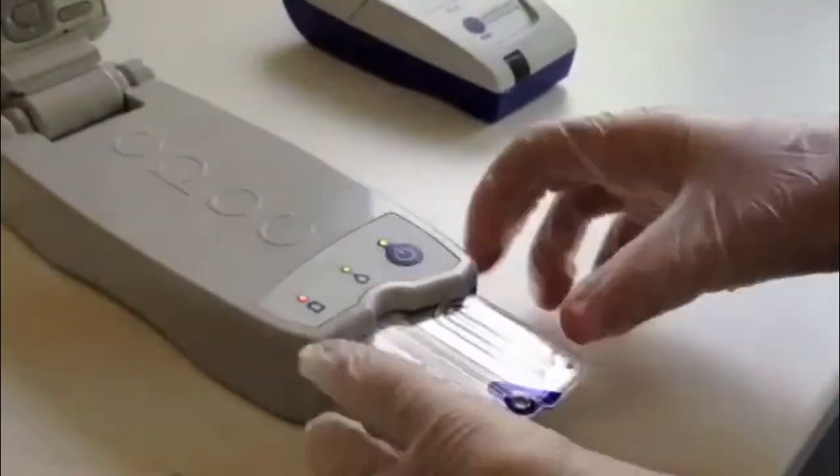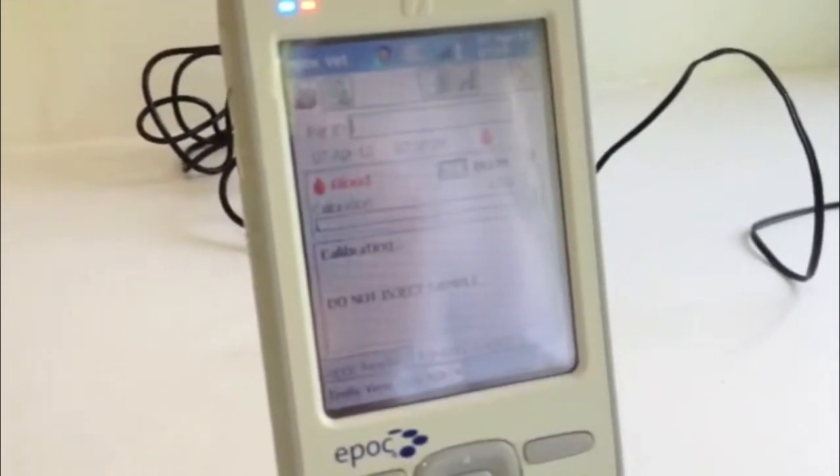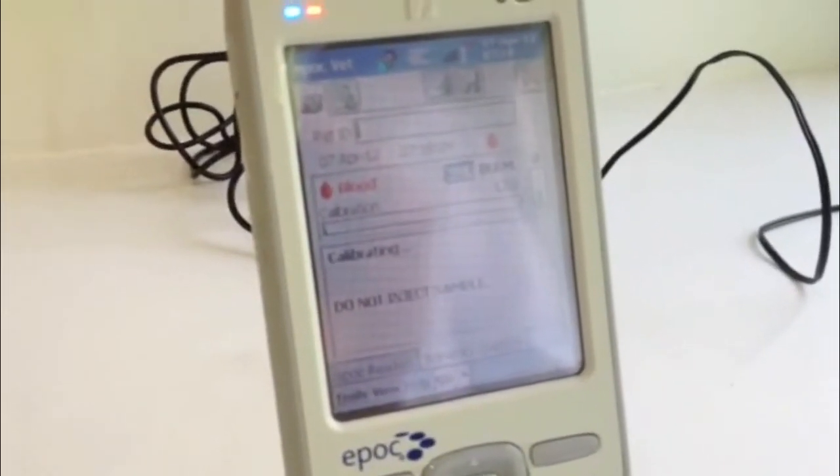If the test card is not inserted correctly — for example too slowly or not fully — then the host will display 'unable to read barcode'. In this case, remove the test card and insert again.